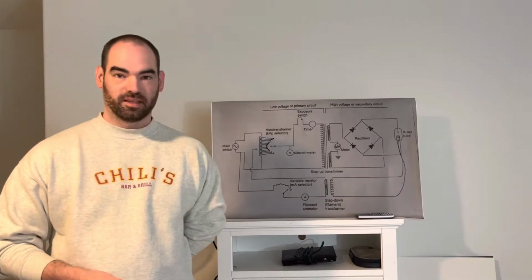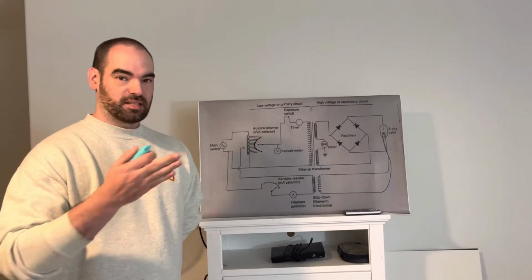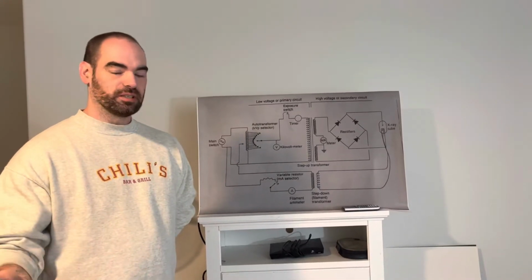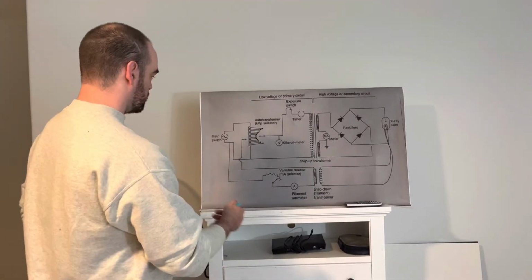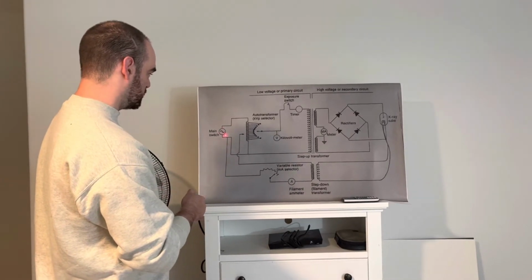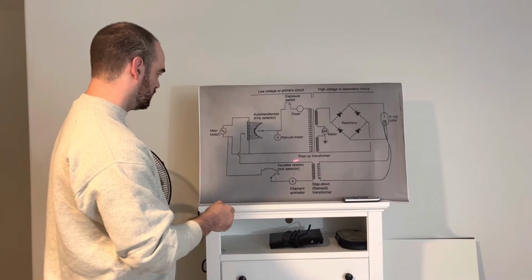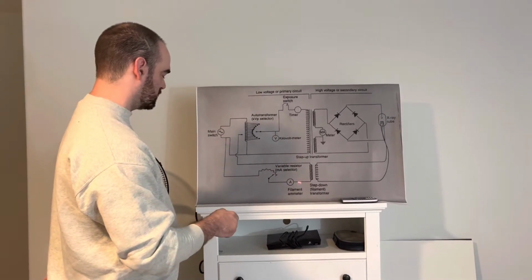I'll be explaining the X-ray circuit and the X-ray tube. At the beginning, before power is turned on, outside of the building, there will be 220 volts. Once the power is turned on, it goes into the building and through the main switch, where there will be three lines: line number 1, line number 2, and line number 3 that goes through the filament side.